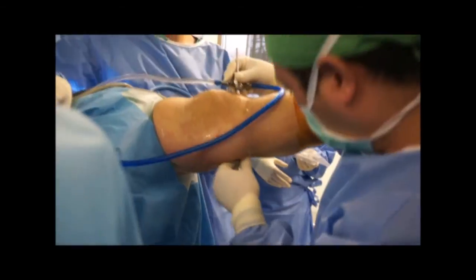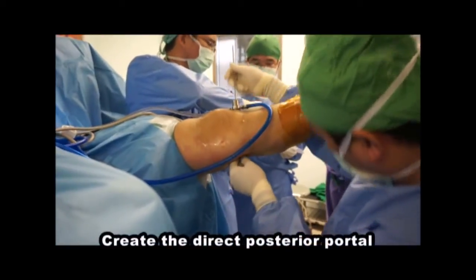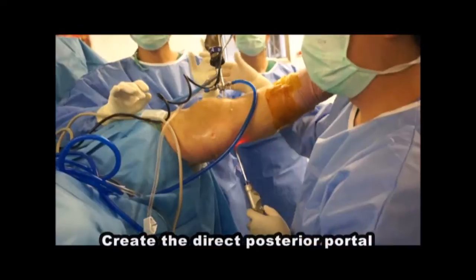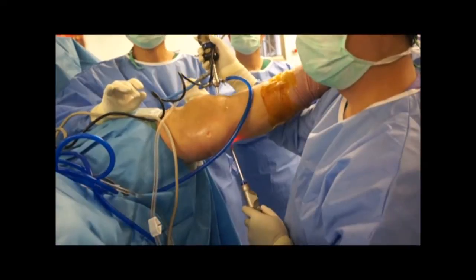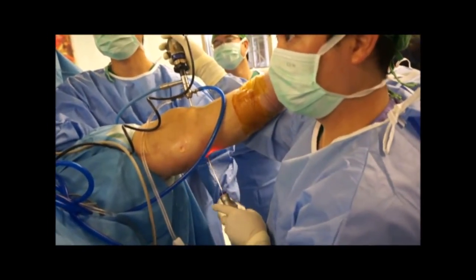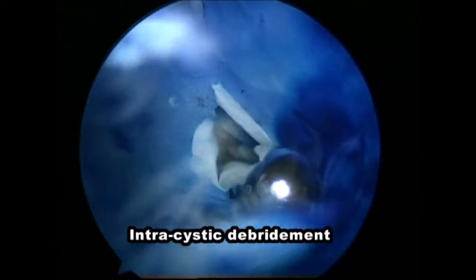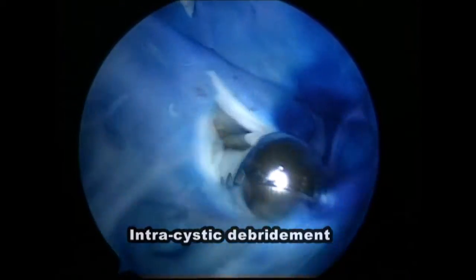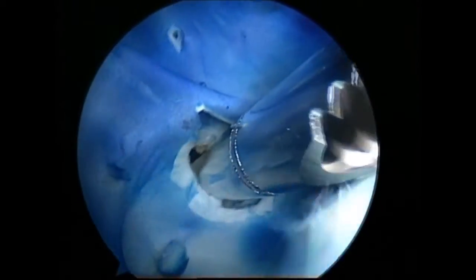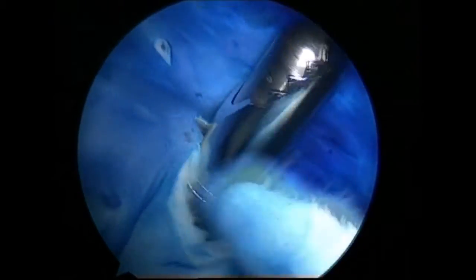The posterior portal is created using the inside-out technique. A shaver is then introduced into the posterior portal to shave out the cyst wall.